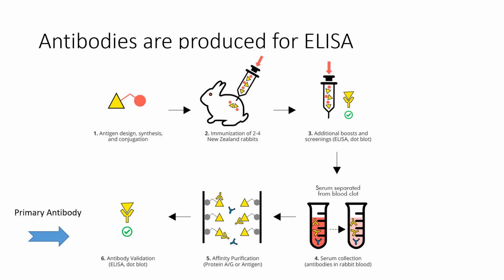Okay, so how are the antibodies produced for this test? So for these ELISA tests, which are used all the time, you start with an antigen that you're interested in. So let's just say right now, and you maybe have heard people say this, what we need is the antibody test or the serology test, they will say, because antibodies are found in the serum, which is in the blood. We need that for the SARS-CoV-2 so that everybody can go back to work, right?